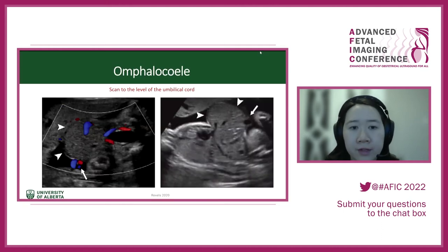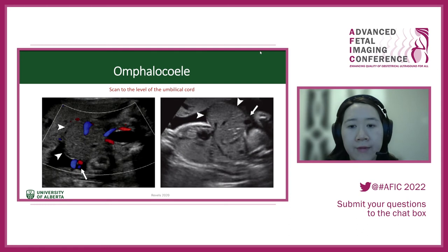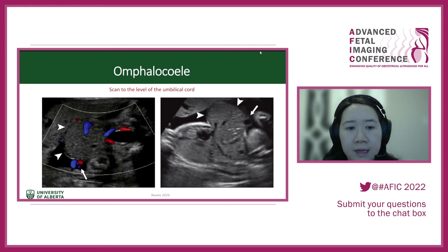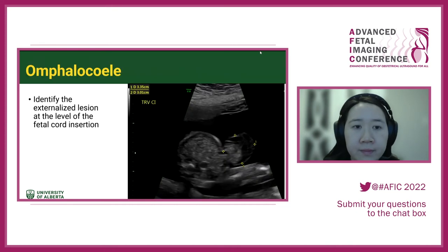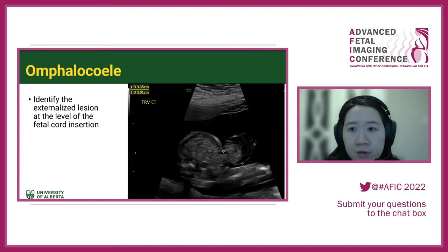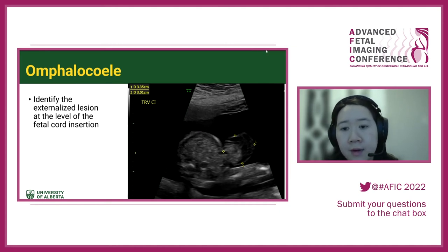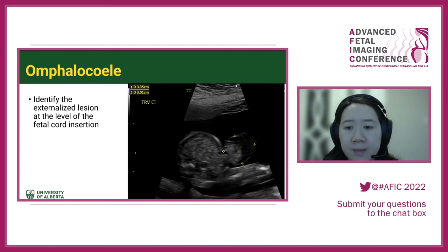When looking at omphalocele, scan down to the level of the umbilical cord and identify where the cord is coming from. On the left image, the arrow indicates the umbilical cord, and the arrowheads indicate the significant abdominal wall defect. On the right side, a sagittal view shows significantly herniated fetal liver. It's important to identify the externalized abdominal contents at the level of the cord insertion.